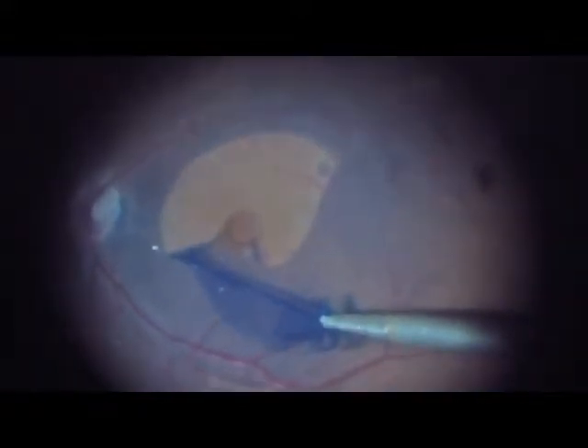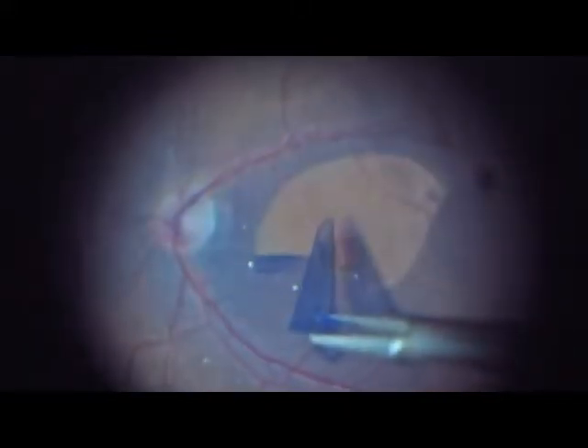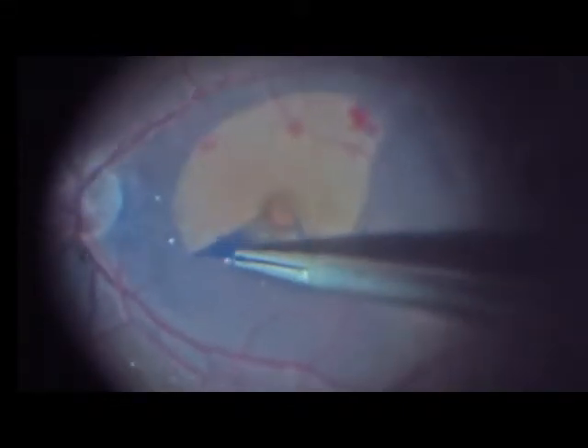We complete the peel, leaving a great part of the ILM intact, as you see. It's very important to get the most of the membrane.